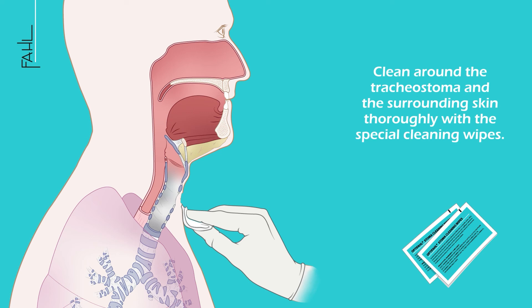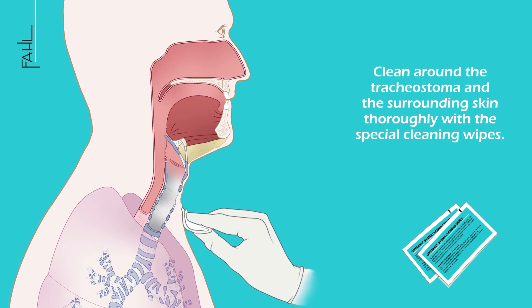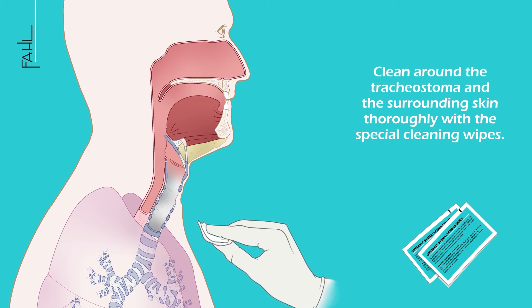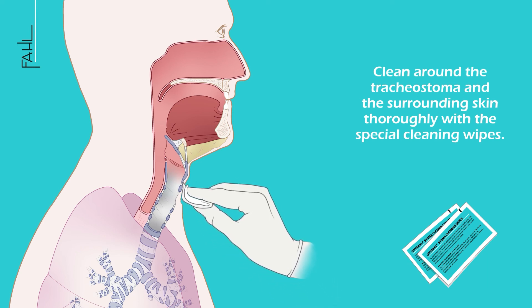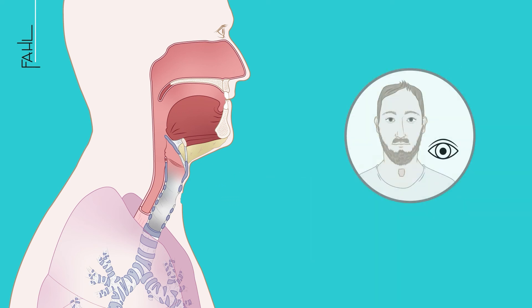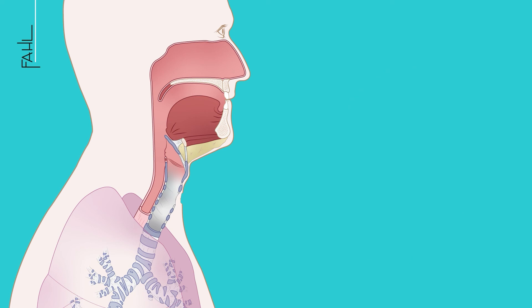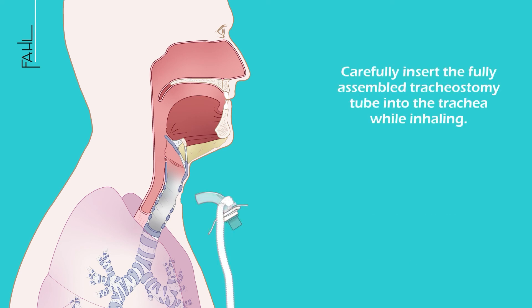Clean around the tracheostoma and the surrounding skin thoroughly with special cleaning wipes. Inspect and examine the tracheostoma and the tracheostomy canal. Then carefully insert the fully assembled tracheostomy tube into the trachea while inhaling.